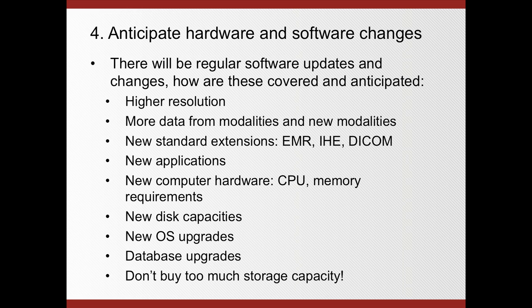There's also already 10 megapixels and multiple 10 megapixel screens. And there will be more data for modalities, of course. A 64 slice CT scanner is pretty common, but it might be 320 within the next couple of years. And then, of course, new modalities.